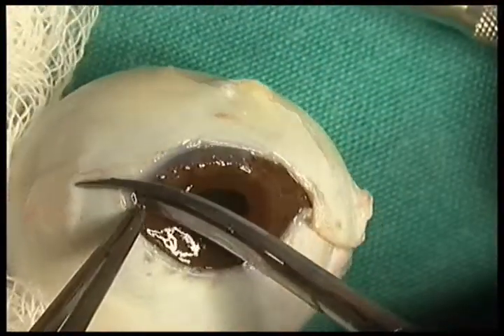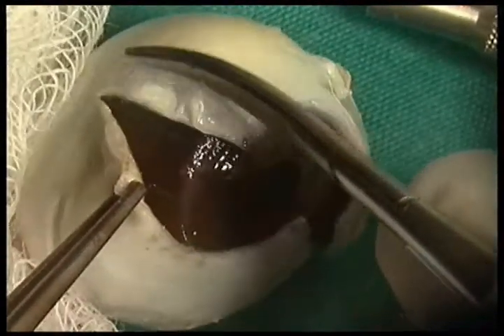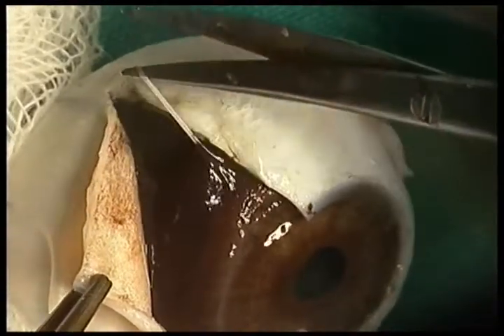Now a second incision is made, separated 180 degrees from the first. The incisions are made up to the equator. In the image we can see a long ciliary nerve.